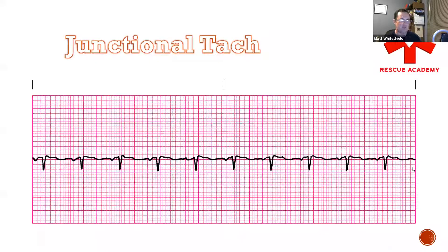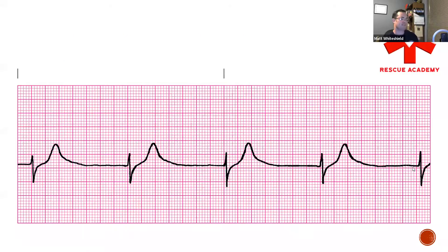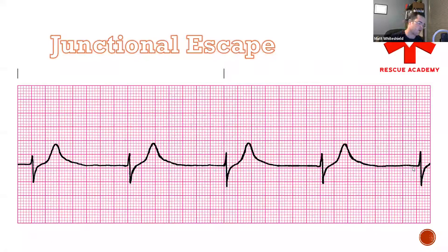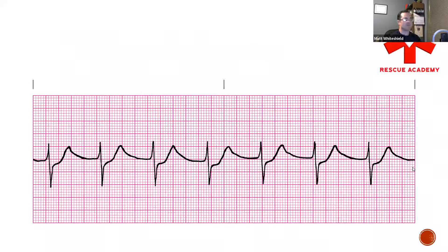Understand that the 6-second strip method isn't super precise — because it's not exact, this rate would have just been over 100 beats per minute. Next strip: rate of about 50, almost on the dot, no P-waves — junctional escape rhythm. Remember, it's still narrow QRS complex, no P-waves, and it is less than 60 but greater than 40. If it's less than 40, we would consider it junctional brady.